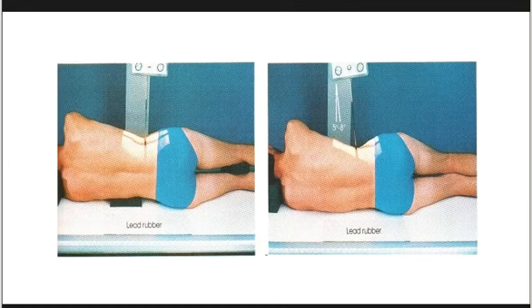Normally, lalo na sa lalaki dahil mas broad ang shoulder ng lalaki. Kaya kailangan nakaangat, no, ang shoulder. So kung nakaangat ang shoulder, kung makikita natin horizontal or rather parallel ang vertebral column in line with the tabletop, then the central ray should be perpendicular or vertically directed.